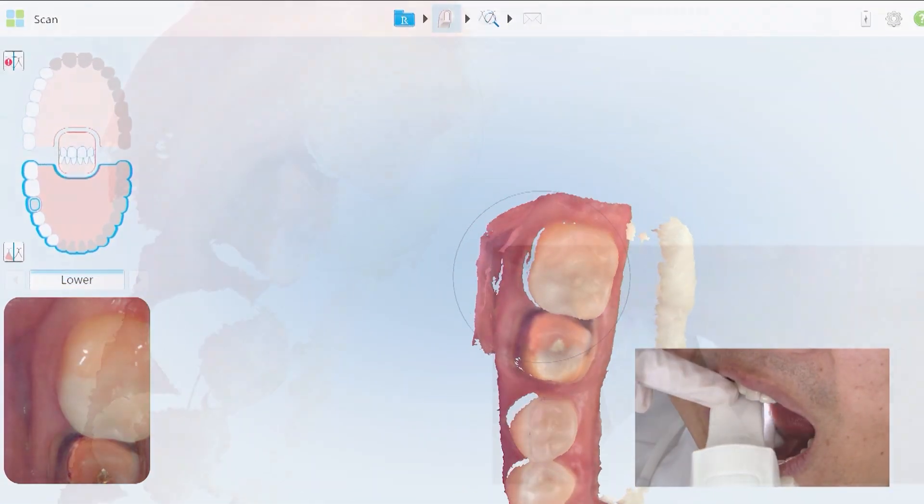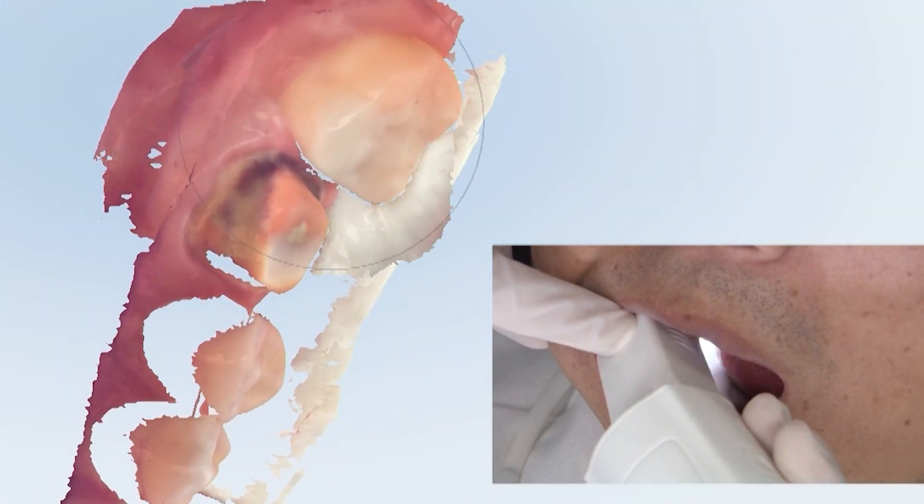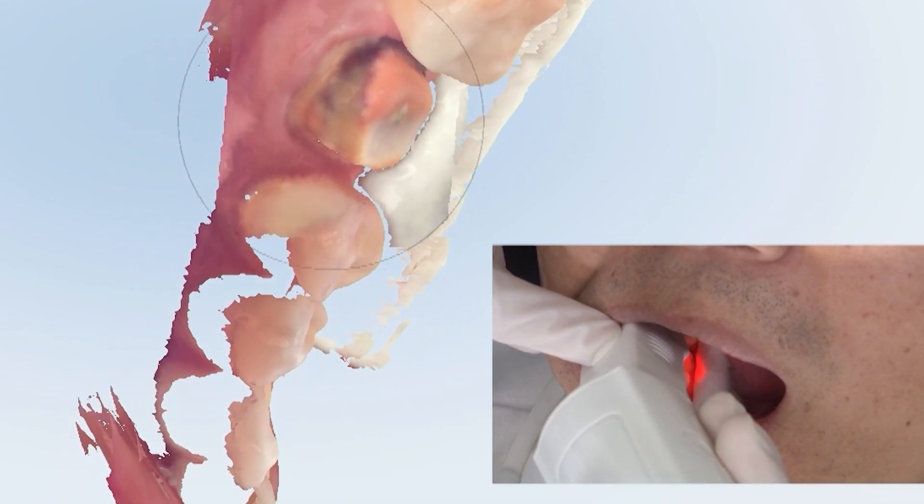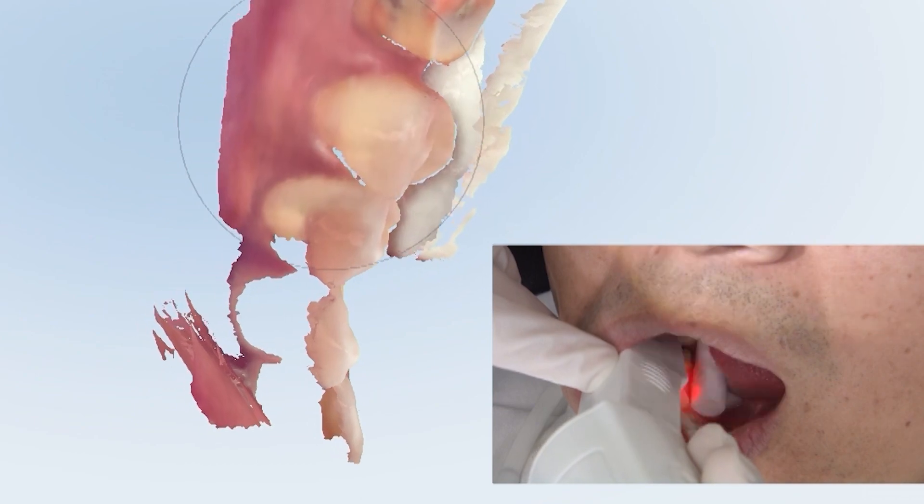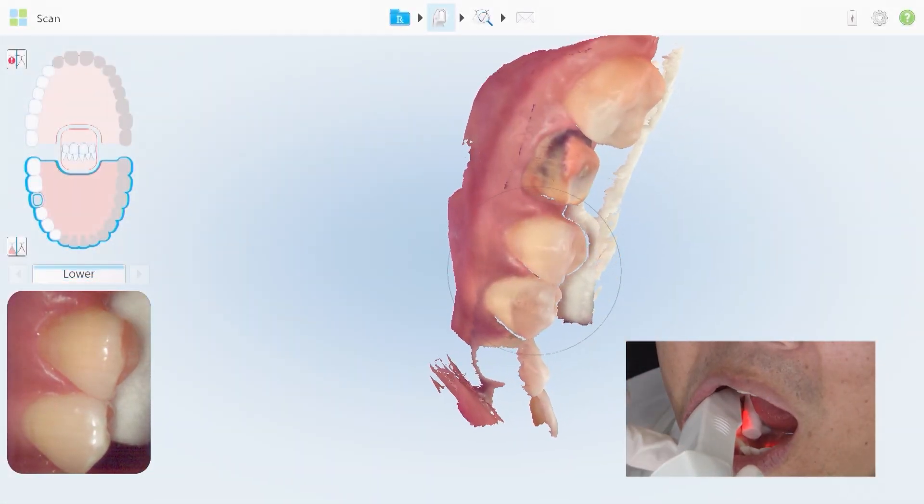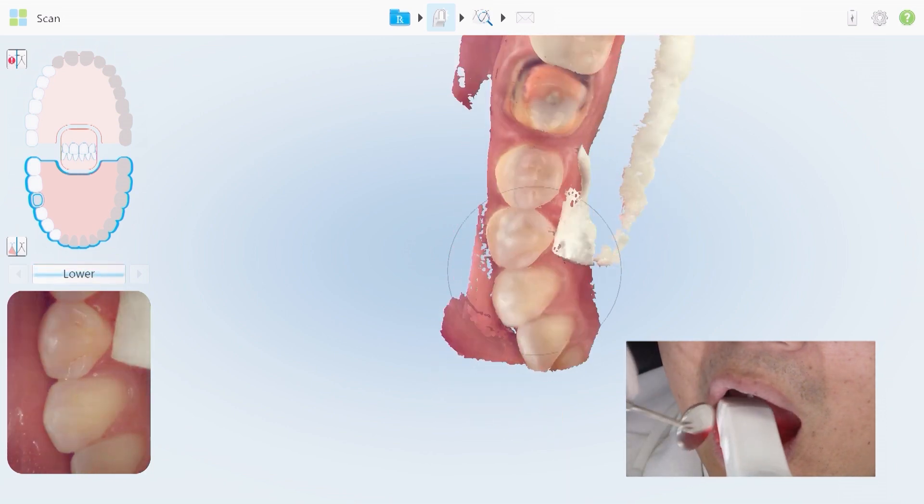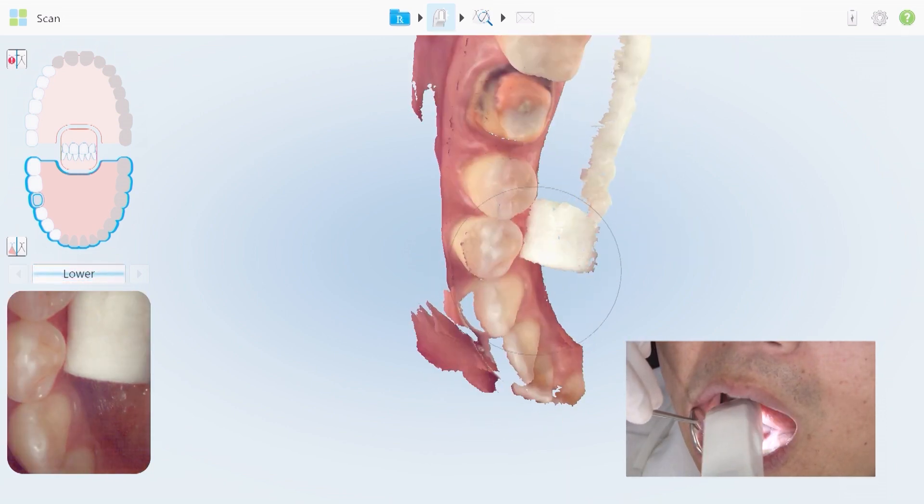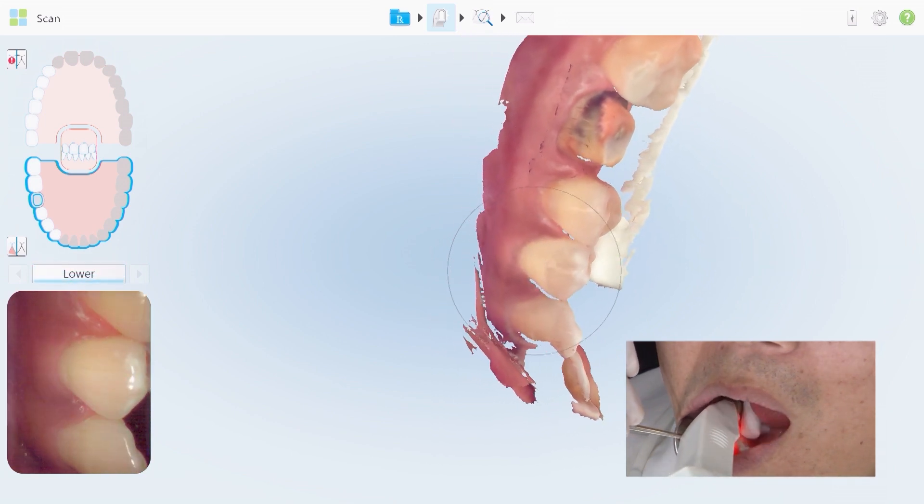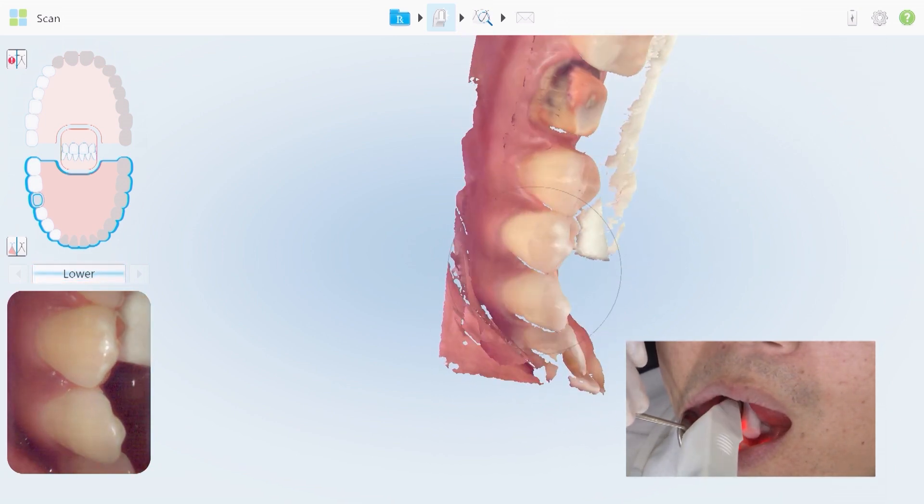Now I'll rotate to the buccal. Once I rotate to this area, I can visualize the buccal surfaces of those teeth, then begin working my way toward the mesial. As we go toward the mesial, the camera may have less chance of retracting the lower lip, so you may need to use either your finger, a mirror, or some type of retraction aid to keep that out of the way as we come closer to the front.